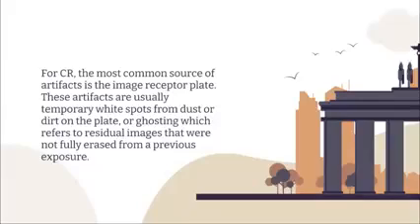Na-scratch ang inyong plate, a non-uniform performance, that means it's because of your aging phosphor, dugay na kayo ginagamit yung phosphor. At times gapang image, at times taas ang density, sometimes taas ang contrast. Dili siya uniform ang pag-produce sa images sa inyong imaging plate, or a substantial malfunction of pixels. There are times magod na ang pixels ninyo, dili na siya mag-function normally. So there will be times na mag-cause of artifacts.